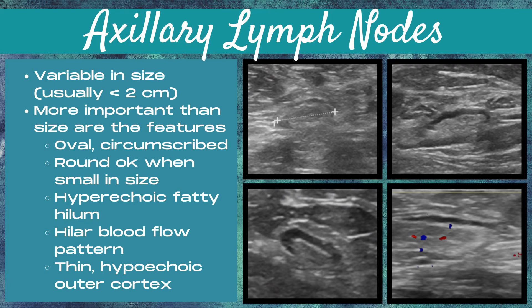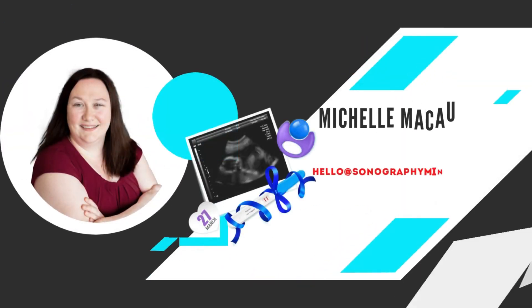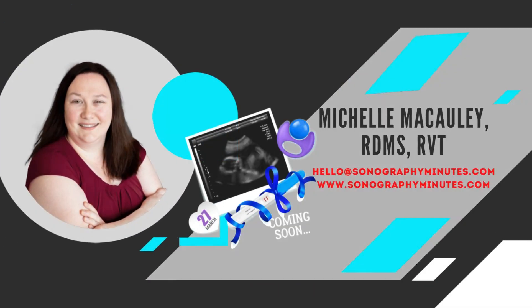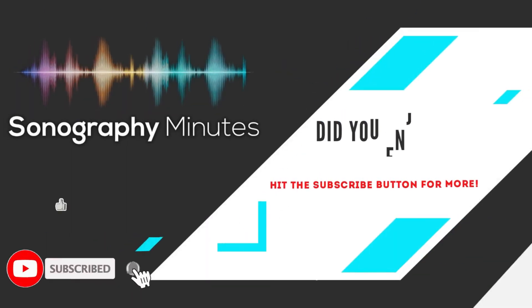Sometimes with axillary lymph nodes, it's very hard to appreciate that thin hypoechoic outer cortex because the hilum either goes all the way to the edge of the cortex and you can't see it at all, or it's just a very thin rim of that outer hypoechoic cortex.